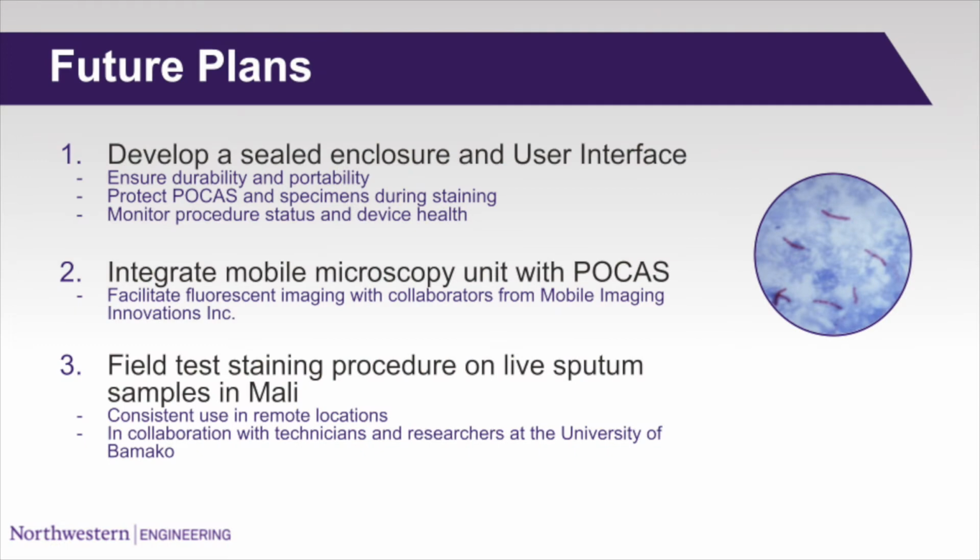We've applied to multiple grants that we will use for the refinement of the POCAS TB so that we can create a carrying enclosure and so we can create a more interactive user display. This funding will go towards establishing performance testing programs so that we can bring the POCAS TB to Mali and test it with our diagnostic technicians on the ground.